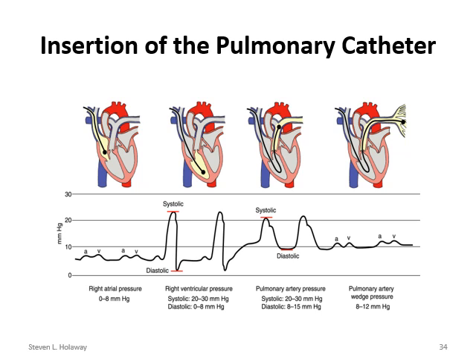As a nurse, your responsibility typically is going to be getting the transducers all set up, making sure all those lines are set up and ready to go. Typically, the physician will hand off to you the part of the pulmonary artery catheter that connects to the transducers, and then have you flush through the lines so that we're ensuring that there's no air in the system. Once the physician gets the introducer in place, they'll go ahead and insert. They'll have you check the monitors, make sure the monitor's working. You'll turn those on. They'll start the insertion of the catheter.